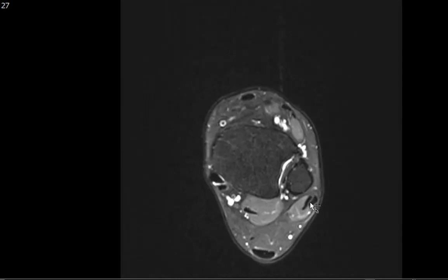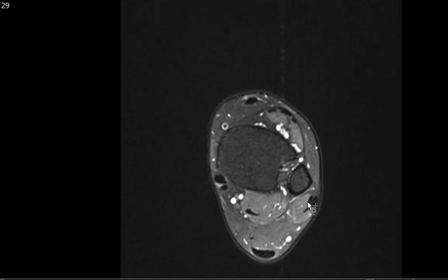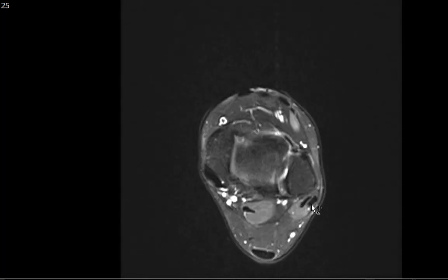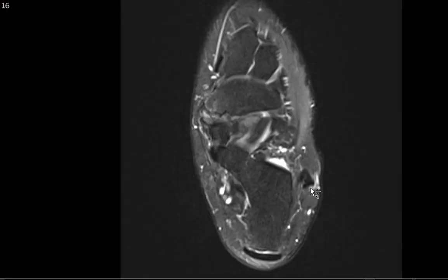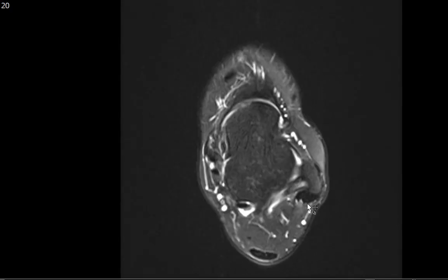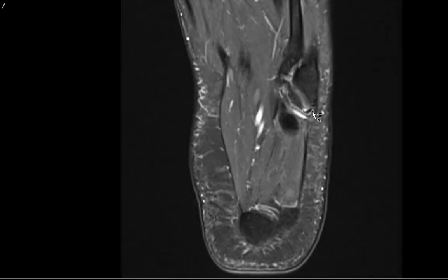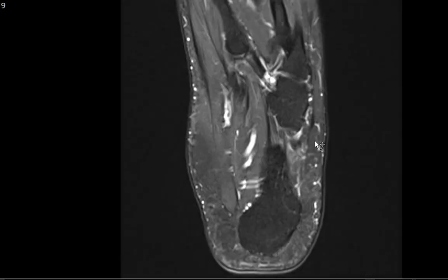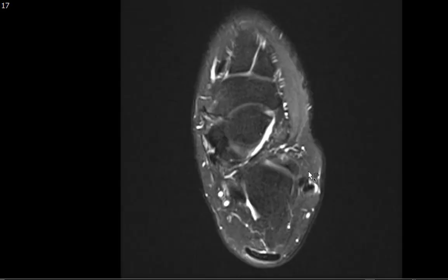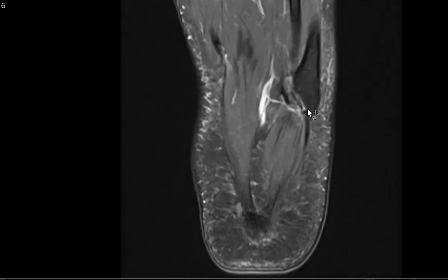The two lateral tendons are the peroneus longus and peroneus brevis. Peroneus longus is more lateral and inserts onto the base of the first metatarsal. Peroneus brevis is more medial and inserts onto the base of the fifth metatarsal. Notice there's no fluid within the tendon sheath suggesting tenosynovitis and no tears. The peroneus brevis can commonly get torn right here along the peroneal tubercle, but notice it looks nice and normal here.